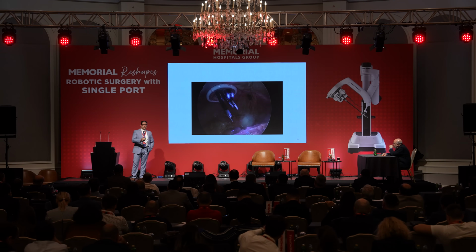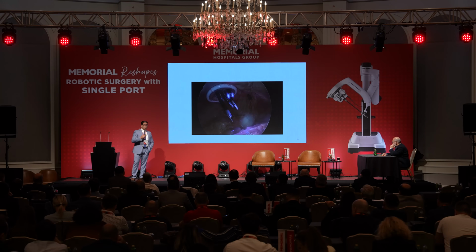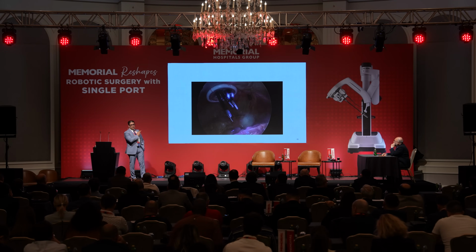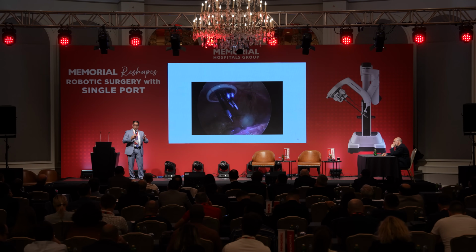I have the luxury to do cadaveric lab for myself, where I try and do things outside of a live human being, so I can try new things without causing harm. So this actually was one of my cadaveric labs. And I recorded myself using the SP to do right hemicolectomy, so I can understand what the ergonomics are, how it works, and what I can do right and what I can do wrong.